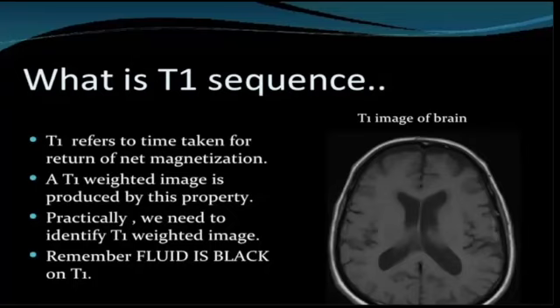I'm going to write it for you because I think this is what you need to know. Okay, so a T1, dark, you're looking at water and rapidly flowing fluid and inflammation. Okay, just write these down. This is important for you to know. If you're looking at something that is bright, however, you're probably looking at blood, which is not moving, or you're looking at fat. Okay, so this is what you're looking at whenever you're looking at a T1 image.